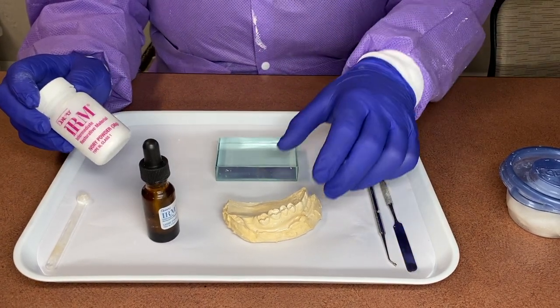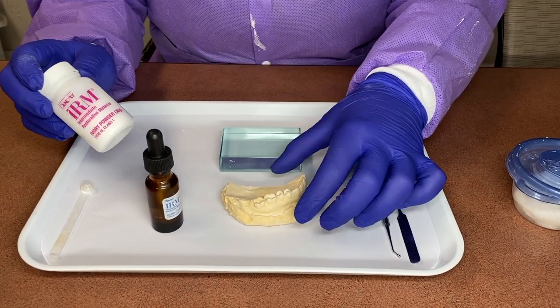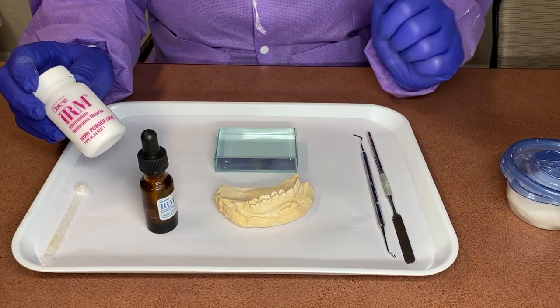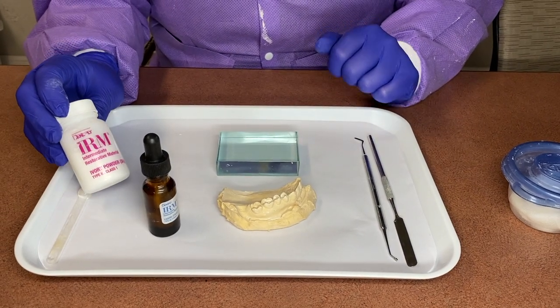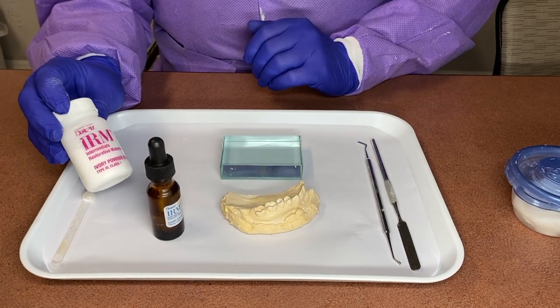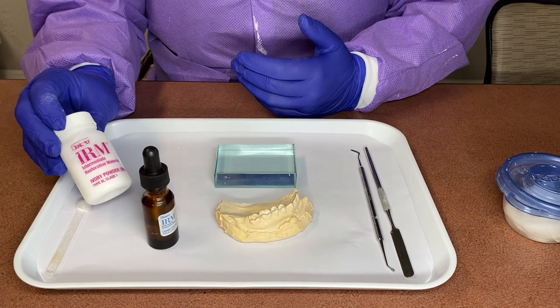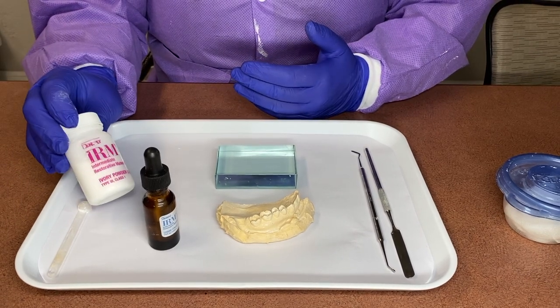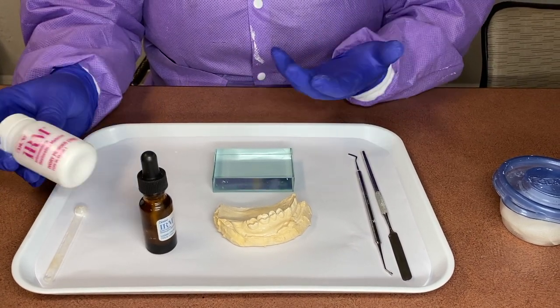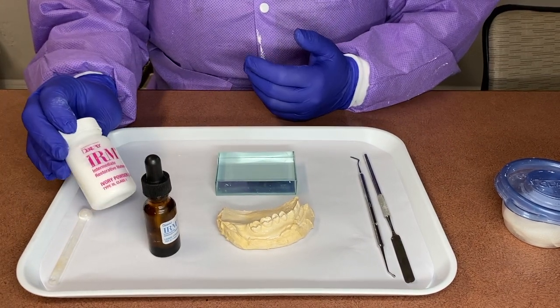The doctor makes a preparation in the tooth. And if it's deep or the patient's having some sort of symptoms for pain, we can place this inside of the tooth in hopes that that will go away. It can be left for a week to 2-3 weeks, and then we remove it and place the filling in hopes that everything gets back to normal and the tooth heals and goes well.